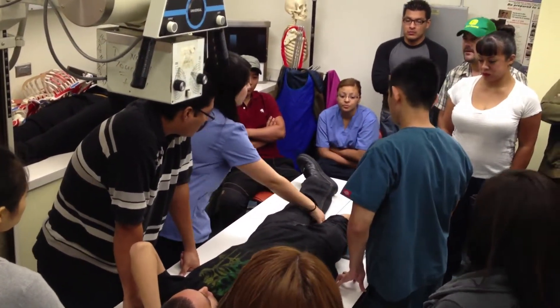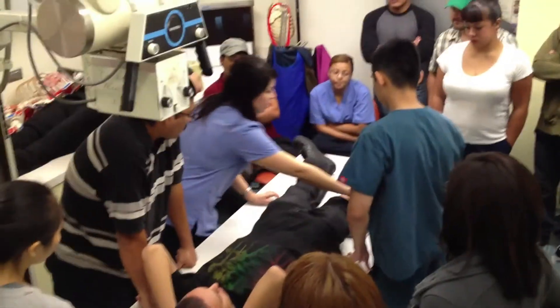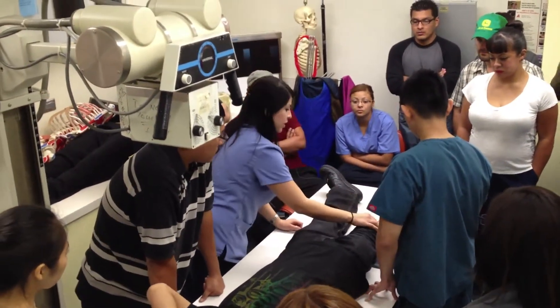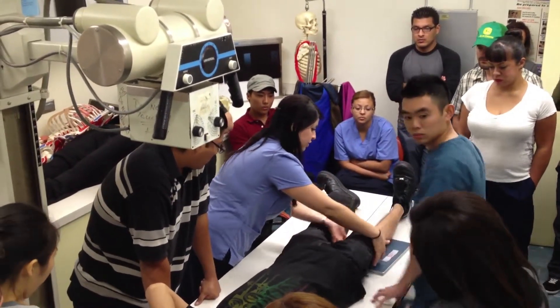We're just using it here to show you the placement on it. But if you want to put Bucky on it — Bucky won't have to cut it. Centering the knee and leaving it open lengthwise is fine on a 10 by 12.